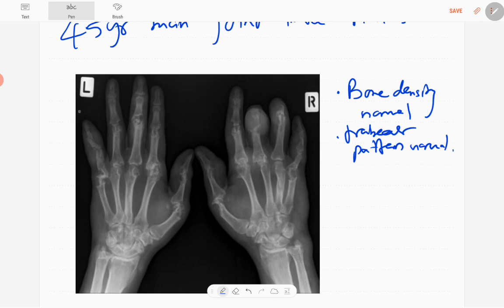Here you can see there is involvement of the first metacarpophalangeal joint, and in fact all the metacarpophalangeal joints are involved. The proximal interphalangeal joints are also involved, and some parts of the wrist joints are also involved.